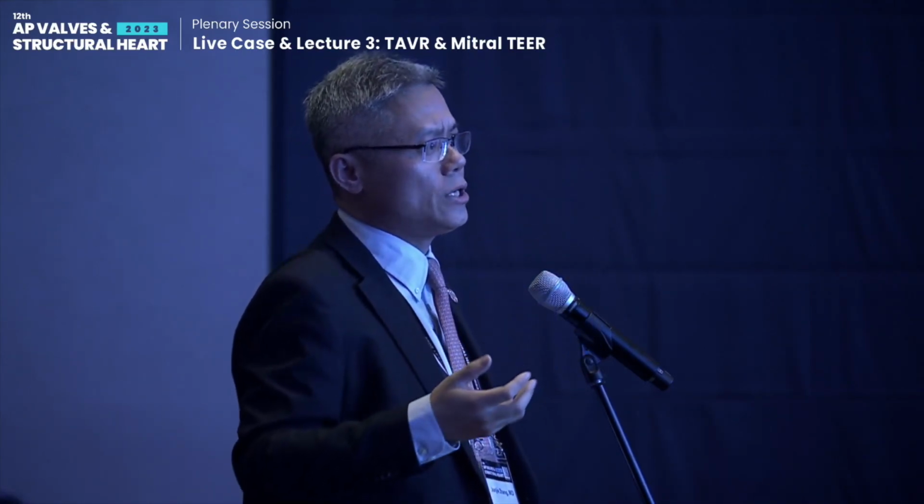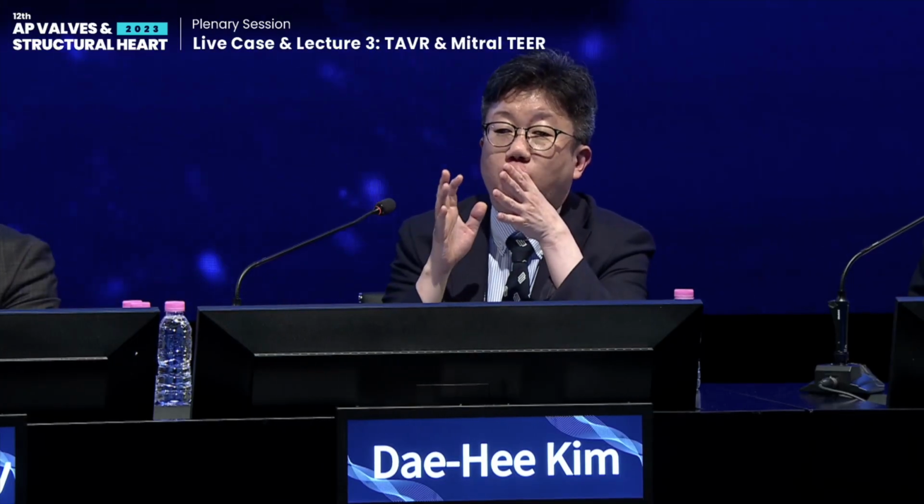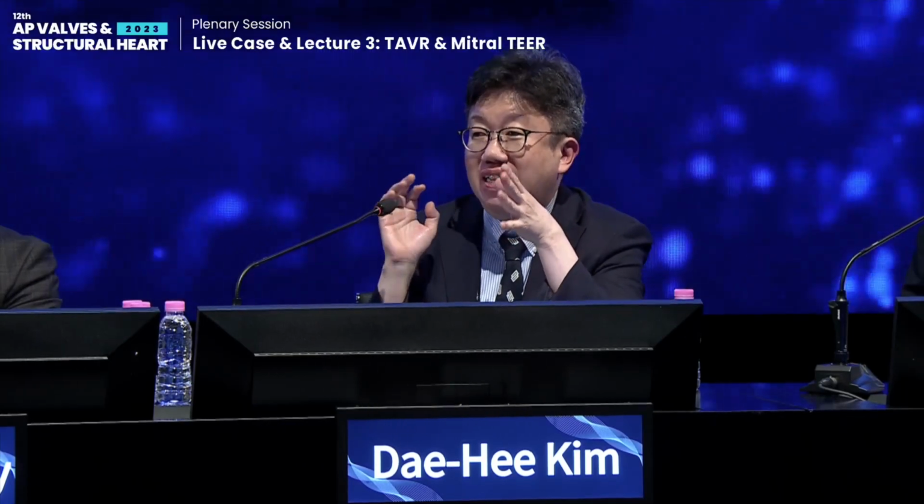After the second generation, the second valve was used quite rarely, the position is quite good, and there is also a low rate of pacemaker implantation. Especially in patients with severe AR, patients with depressed ejection fraction usually have a larger annulus area, I think.